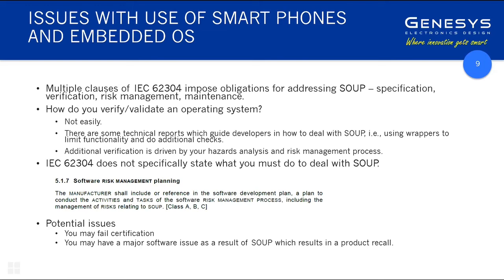If that is the only way of showing critical information that would otherwise cause a hazard or a risk of harm to a patient, then we strive to use displays completely controlled by us, so that we don't have to worry about these additional things that SOUP raises.